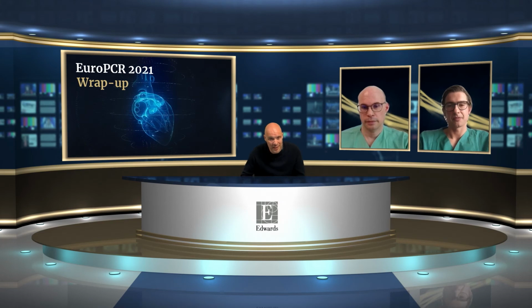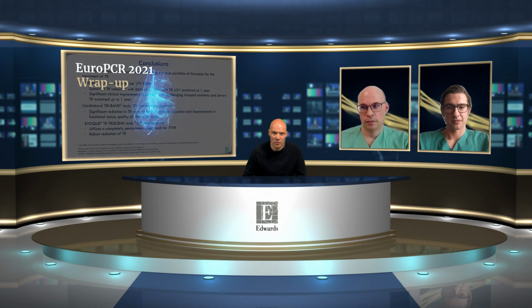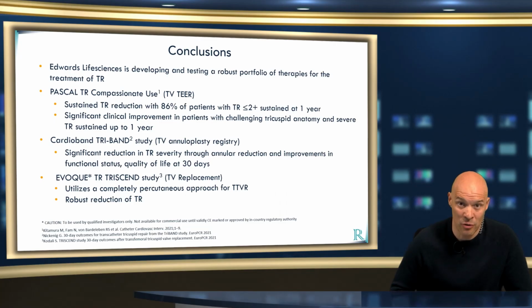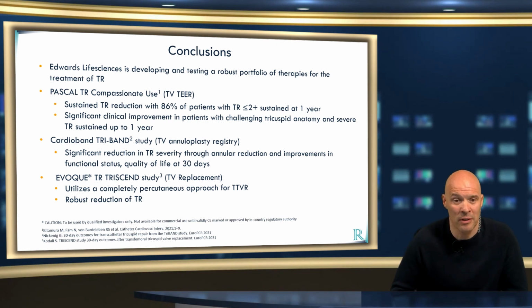I think it's fair to say that Edwards Lifesciences is developing quite a robust portfolio for the treatment of tricuspid regurgitation. We saw a very nice overview of what the Pascal technology can do for tricuspid regurgitation. Over 80% of the patients will have moderate or less residual tricuspid regurgitation, and this will affect the patient's well-being and might even affect overall longevity of these patients.